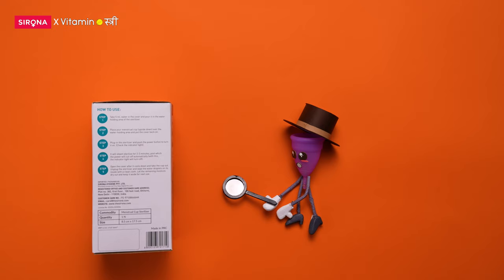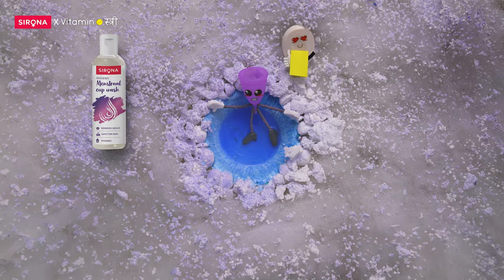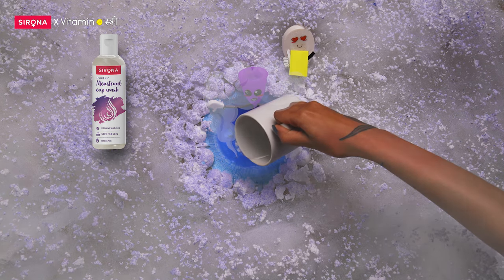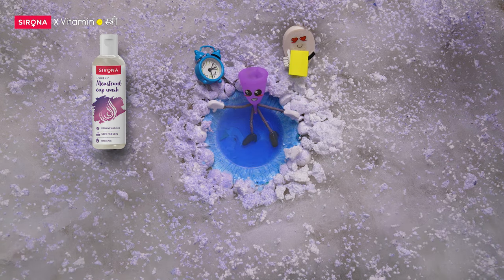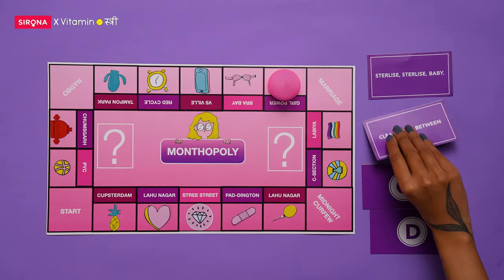Sterilize, sterilize baby! Always read the label and sterilize your cup well. Use a good old unscented soap, wash and boil in water for up to 10 minutes before and after each cycle. You can also use a sterilizer for cleaning in between.